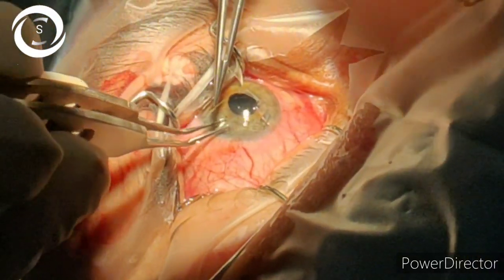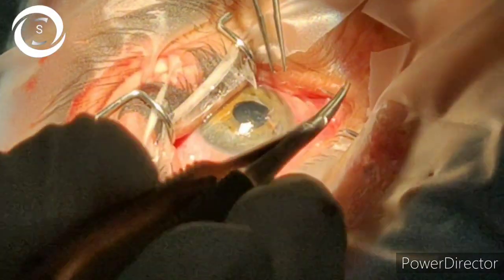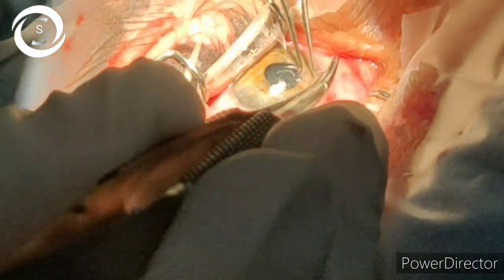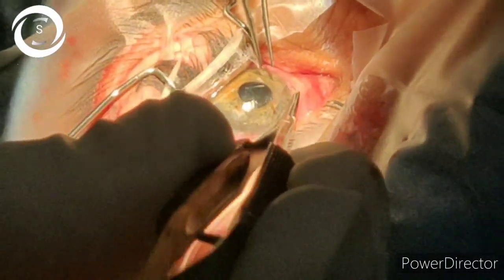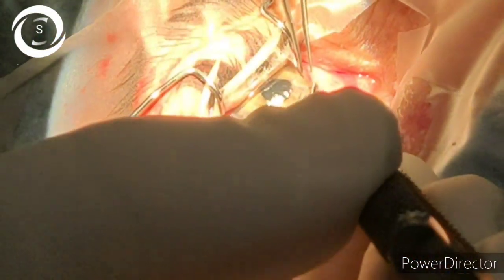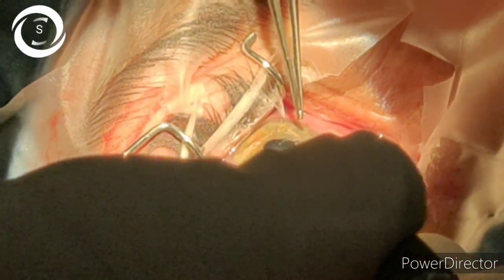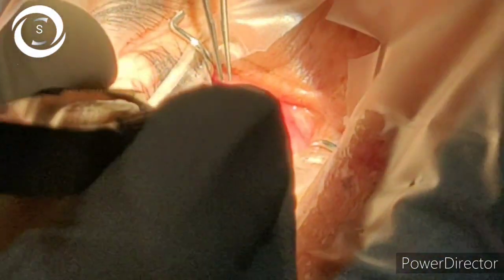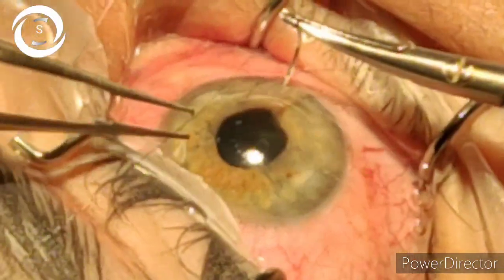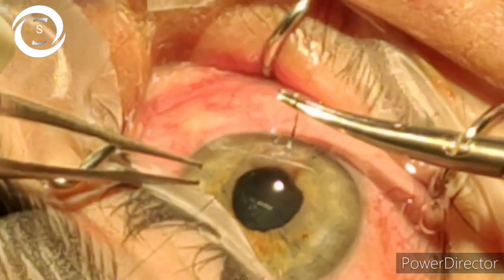We are about to complete the second horizontal suture for this square-shaped inferior corneal wound extending up to the inferior pupillary margin. I am now starting the first vertical suture. The view of the first vertical suture is not ideal because my hand is obstructing the view, but you can observe the hand movements — how you have to pass the needle from one end of the wound to the next, making sure you don't go into the pupillary axis.